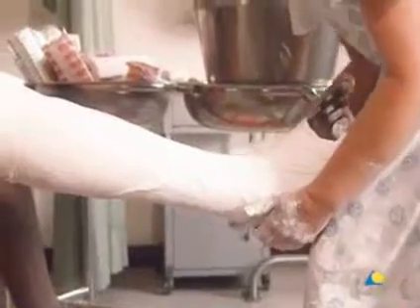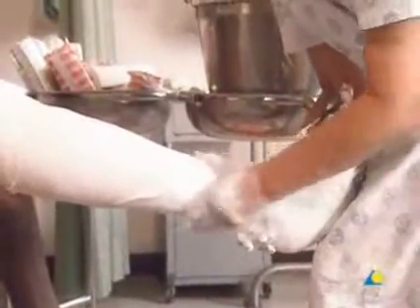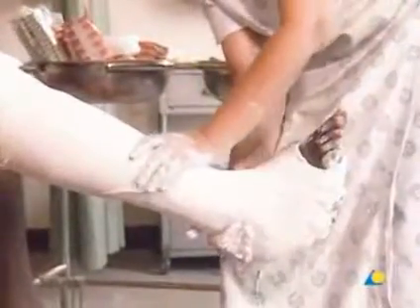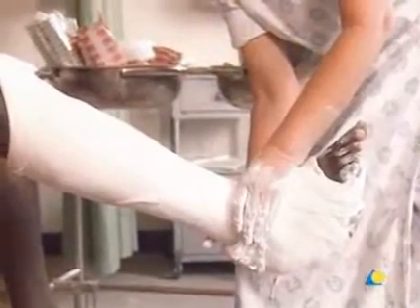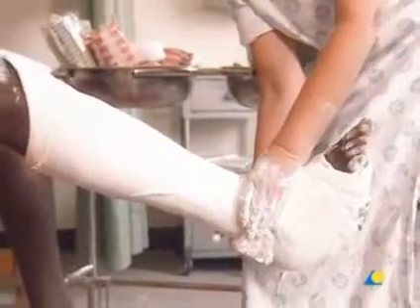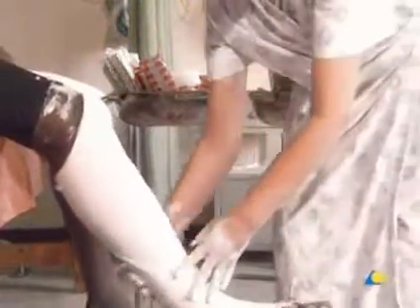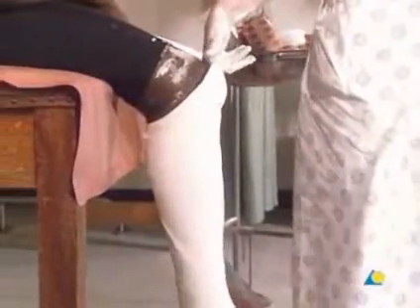The plaster is smoothed. The secure fit of the cast is verified by having the patient attempt to rotate the leg; a secure fitting cast will prevent rotation. Flexion at the knee is also checked — the patient should not be able to flex the knee more than 90 degrees.